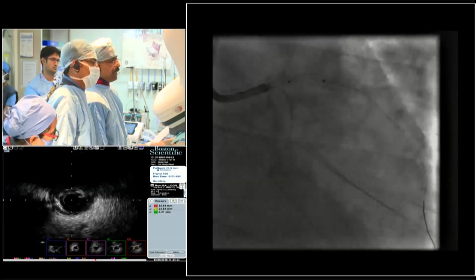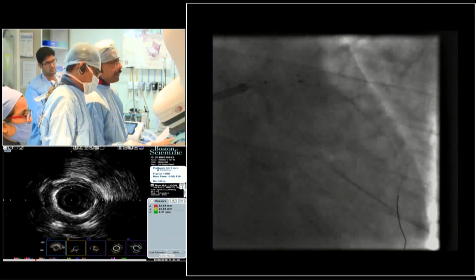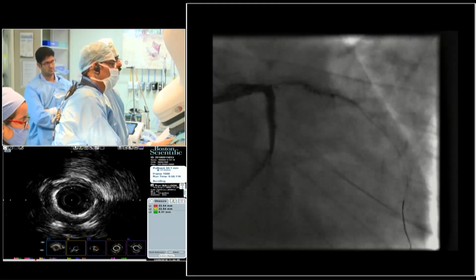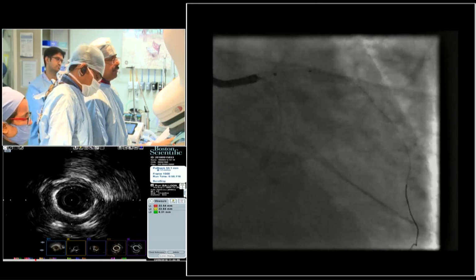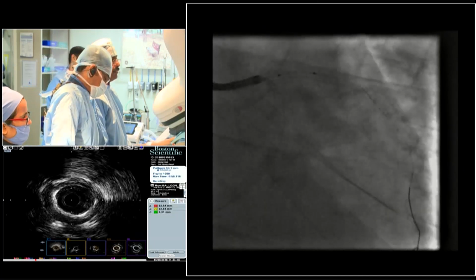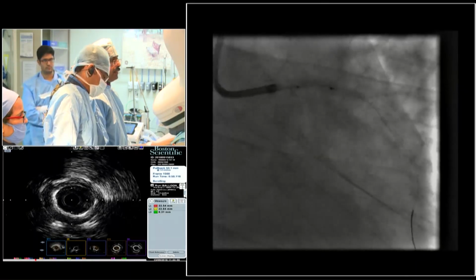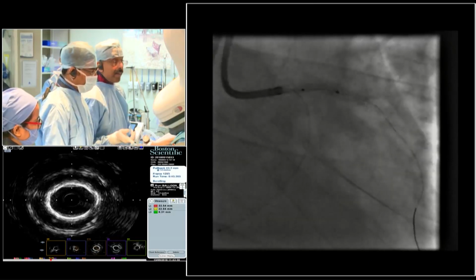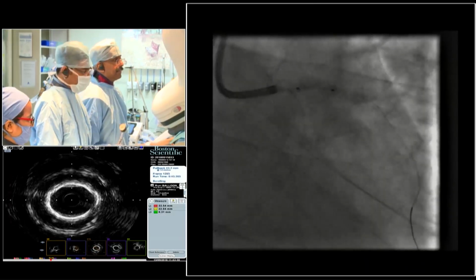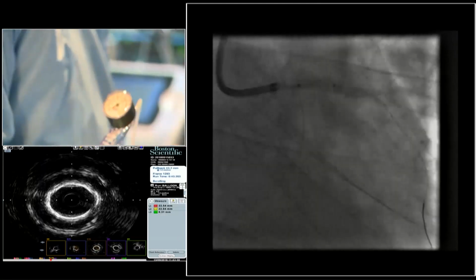Okay. So this has gone up to 35. We are reasonably okay. It looks much better than the other AngioSculpt and stuff like that. We're going to go up 30, 35. Can you show the indeflator? How does it look? The one which goes up to 55. It is a similar one. Okay, it shows up to 55. I am at 30, 35 now.